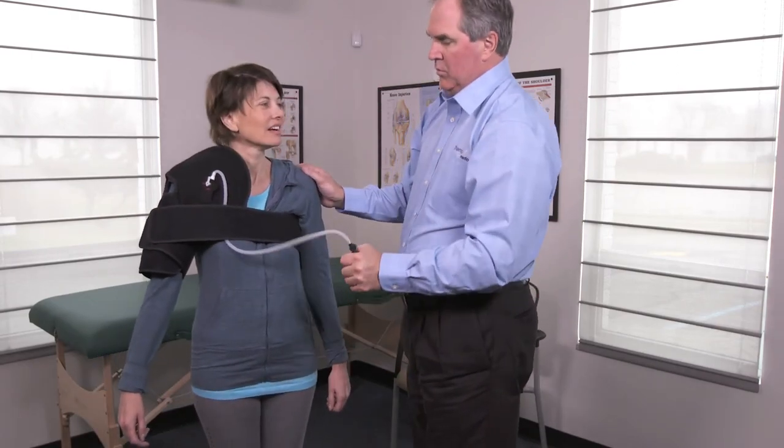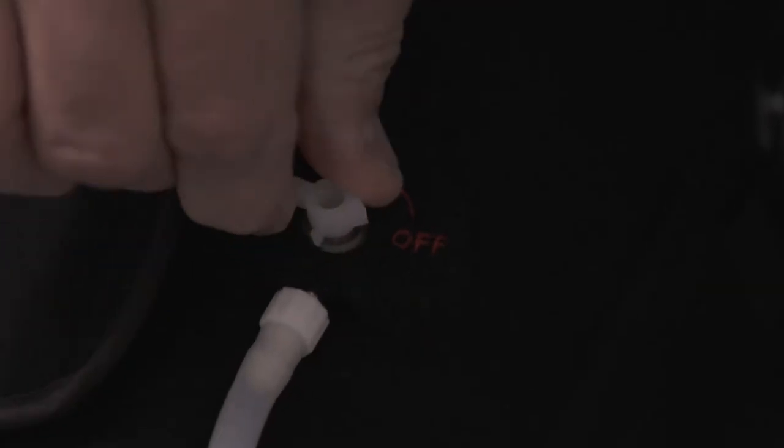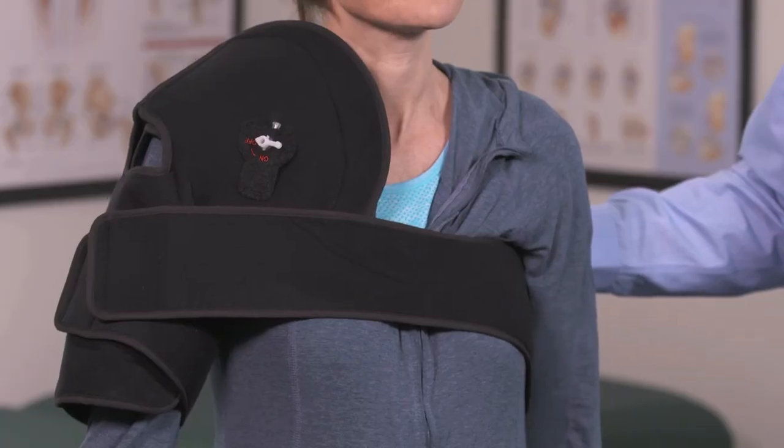Using the hand compression pump, add air to the compression section. Turn off to lock in air. Detach the hose with a half counterclockwise turn. Check for appropriate fit and patient comfort.